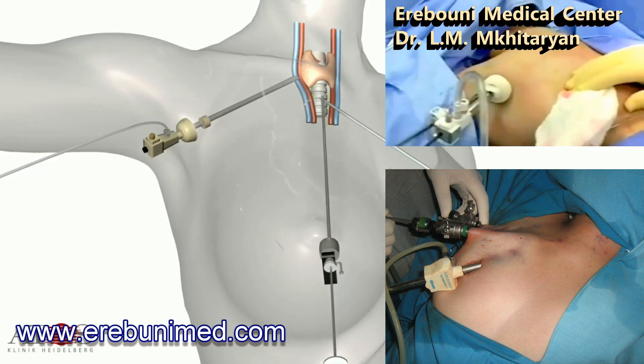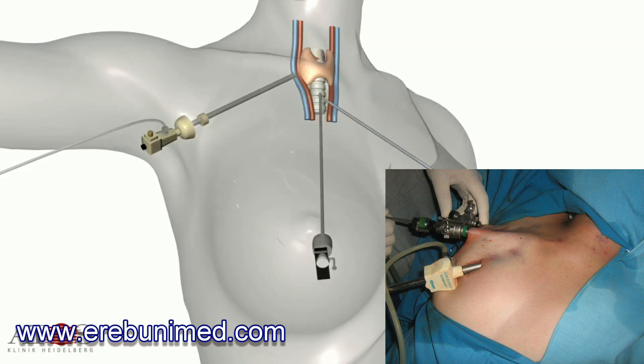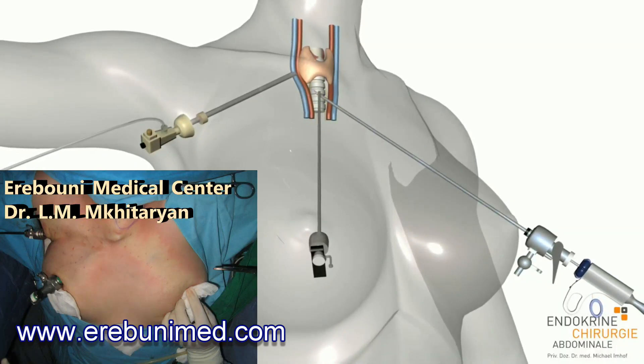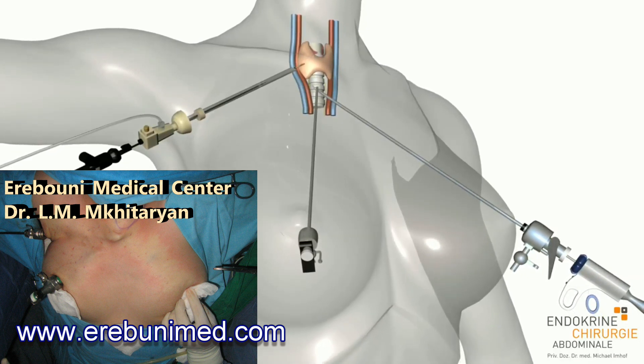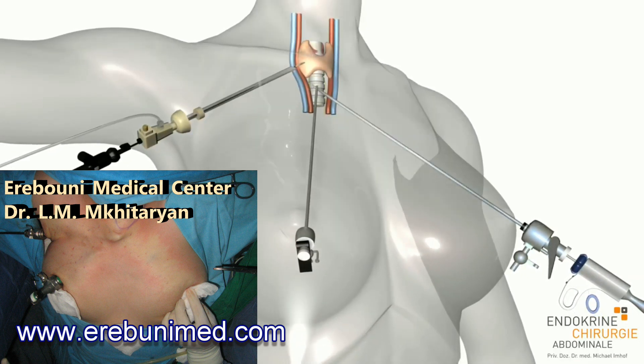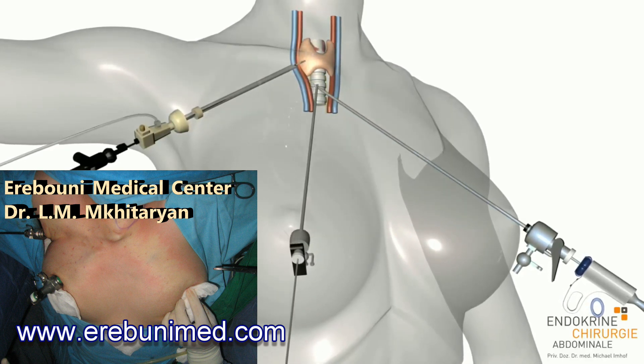The trocar on the right-hand side is for the ultrasonic shear. The one on the left is for the neuromonitoring probe and the alligator forceps. The trocar in the middle is for the camera. During the operation, the surgeon can watch the entire area on a large monitor.